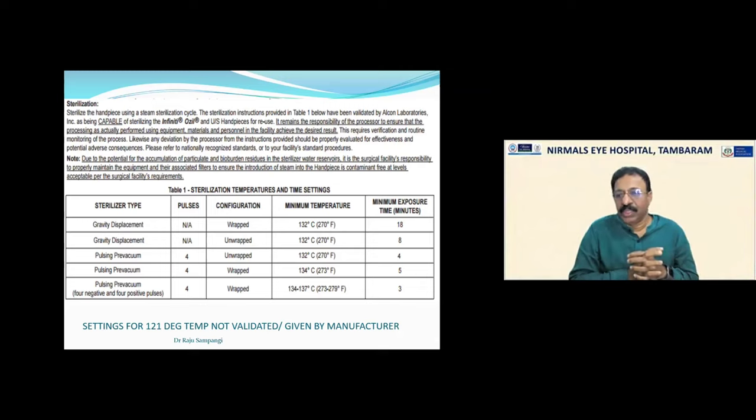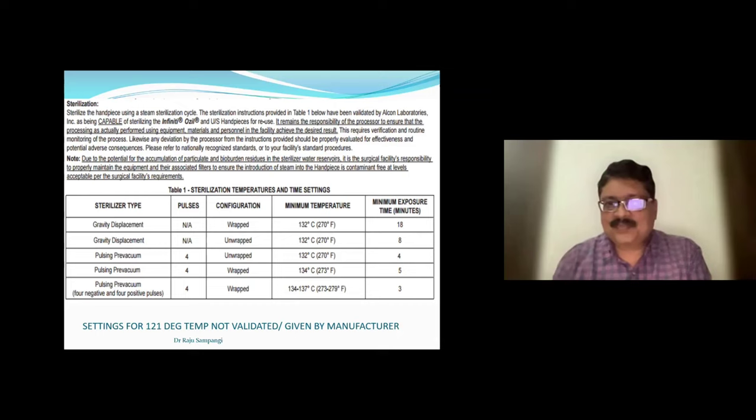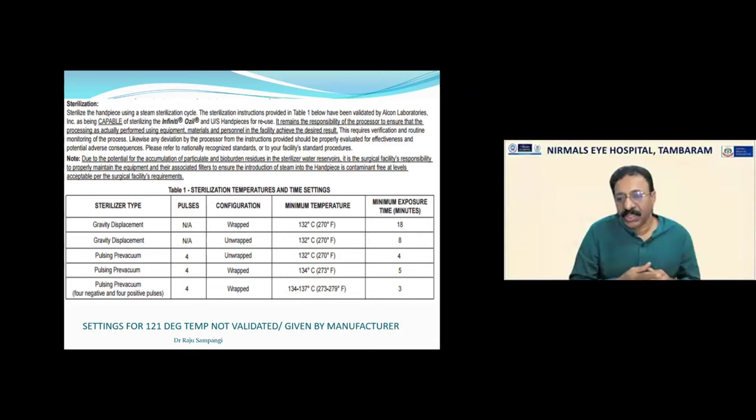See, generally you are dependent on the technician to write this data document and then make it part of your medical records. When you have a printout, you just take the printout and stick onto your medical record, or you update it into your EMR. So it just makes the process easier, and also reduces the human error.